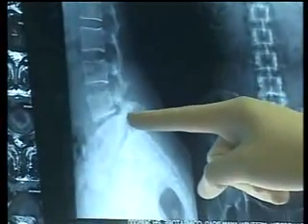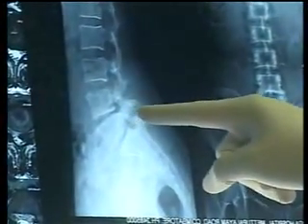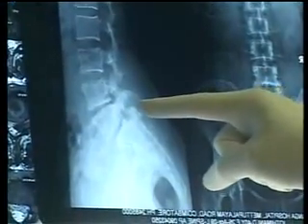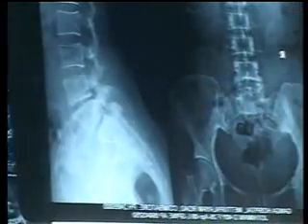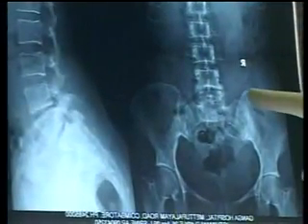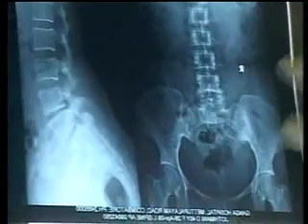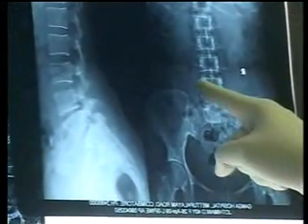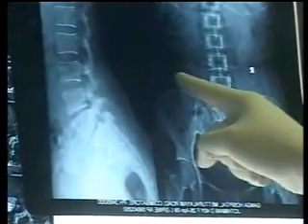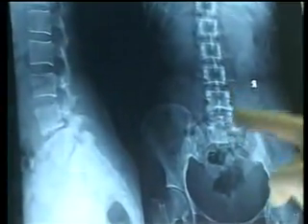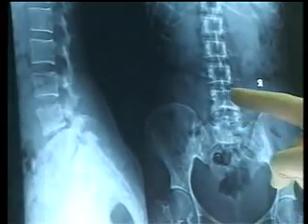The X-ray shows normal lordosis, no disease in the bones, and no listhesis. We are going to target the fragment through the foramen of L4-5, above the crest, from the left side.